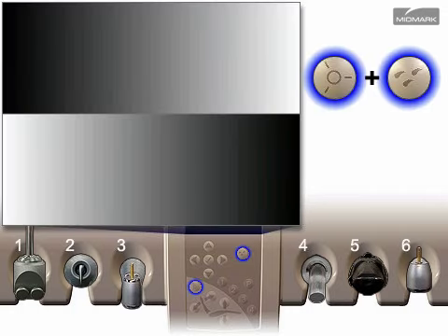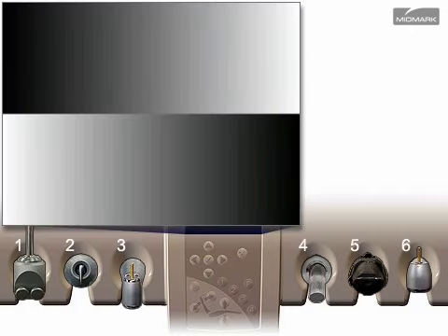Press the light and water buttons at the same time to continue. The unit has five display diagnostic screens. The gradient screen, shown here, appears when the display is working properly.